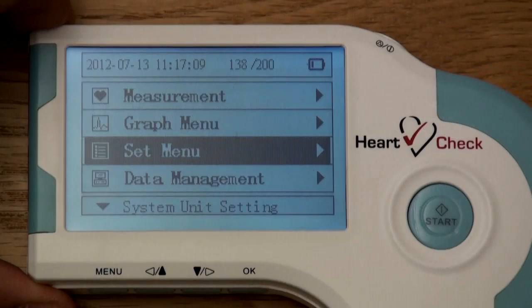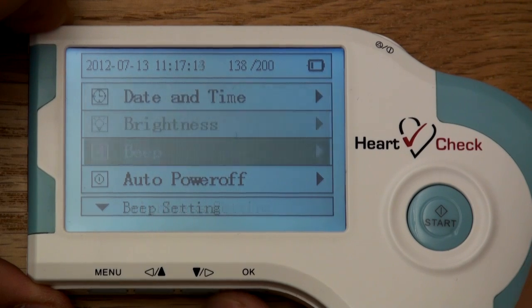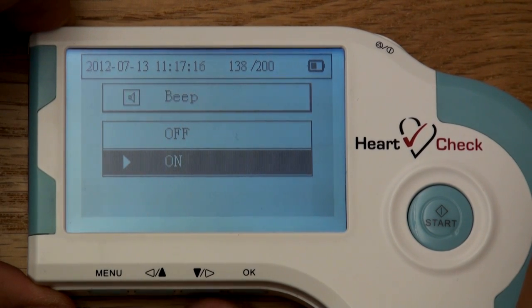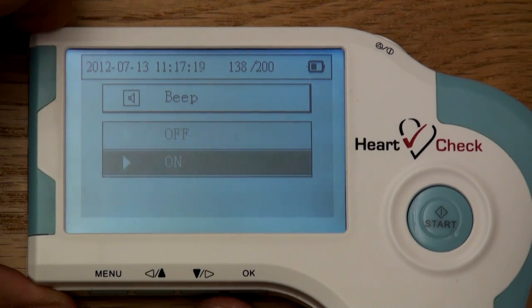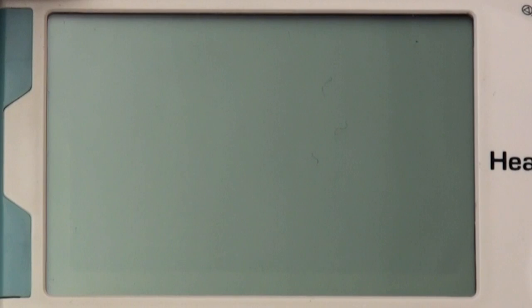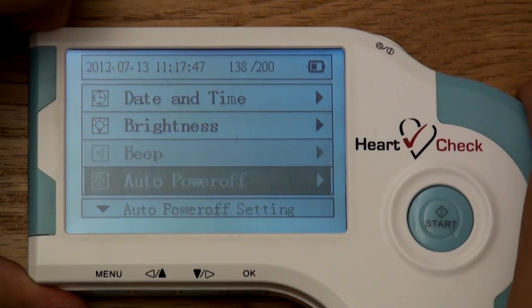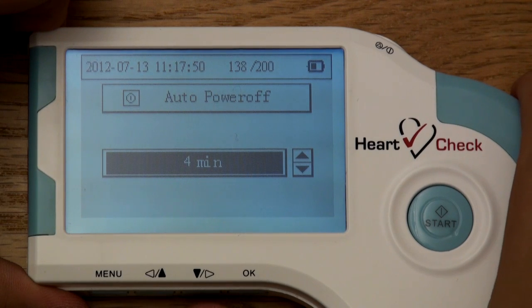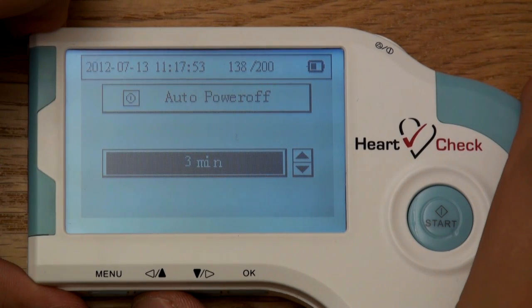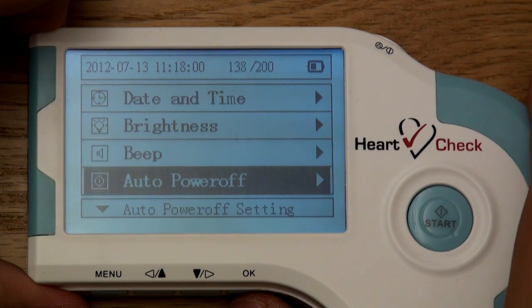Turning the beep on and off. By default, the device will produce a beeping sound when taking a reading. You can turn off the beeping sound by scrolling to and selecting the beep category within the set menu section. Here, you can select off to turn the beeping sound off, or on to turn the sound on again. Adjusting auto power off. If left untouched, the HeartCheck ECG device will automatically power itself off after a given period of time. You can adjust this feature by scrolling to and selecting the auto power off category in the set menu section. Use the arrow buttons to increase or decrease the amount of time it will take for the device to turn off if left untouched.